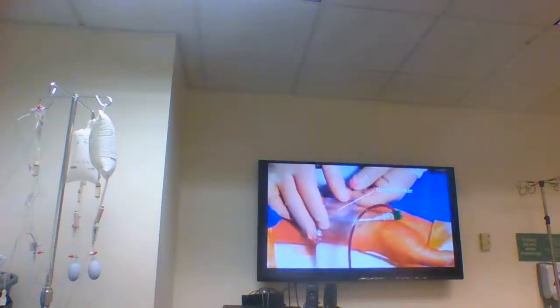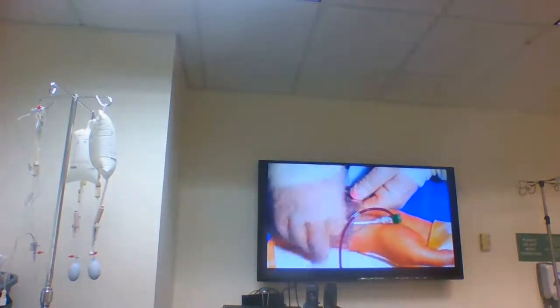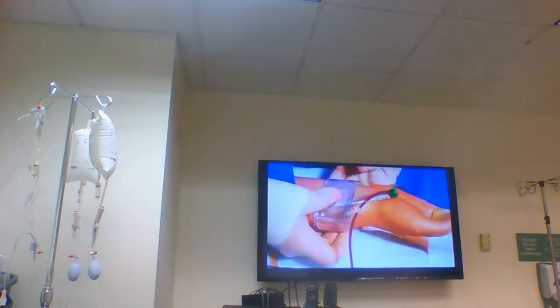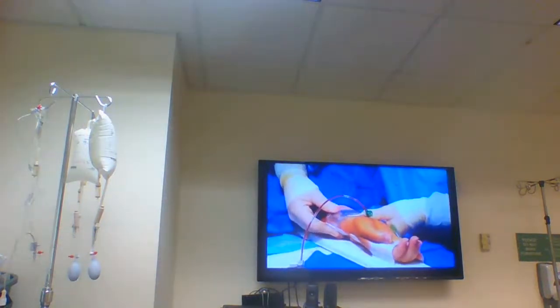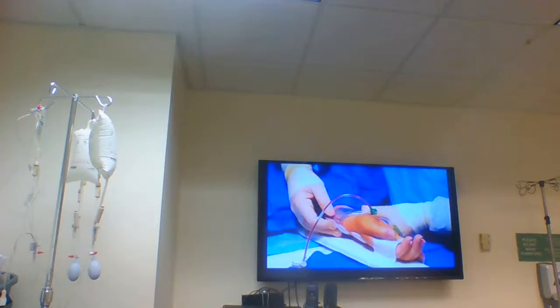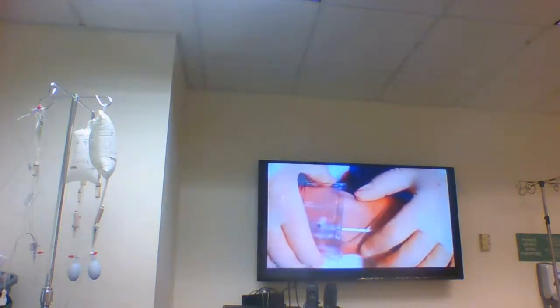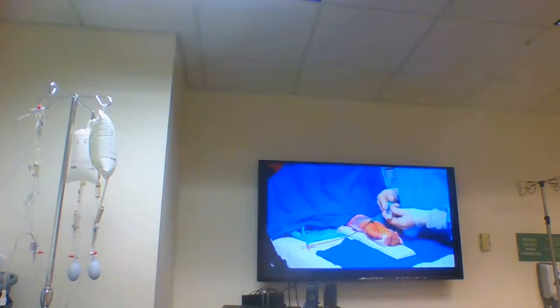It is also important to align the green marker about 1 to 2 millimeters proximal to the puncture site and fix the strap on the wrist with the adjustable fastener. The green dot is located on the center of the compression balloon. Placement of the green dot is important because it ensures that the balloons are appropriately located on the radial artery to control bleeding.